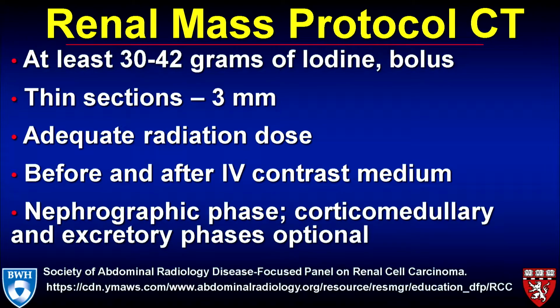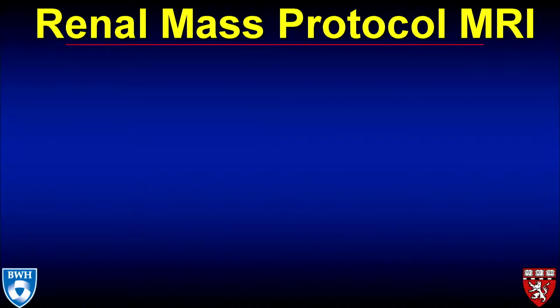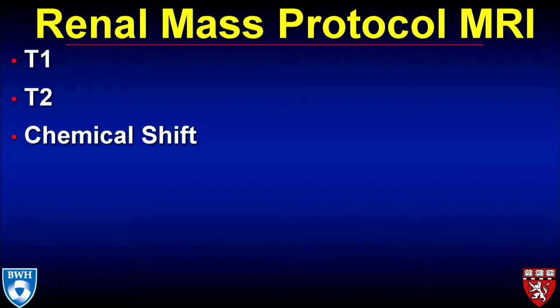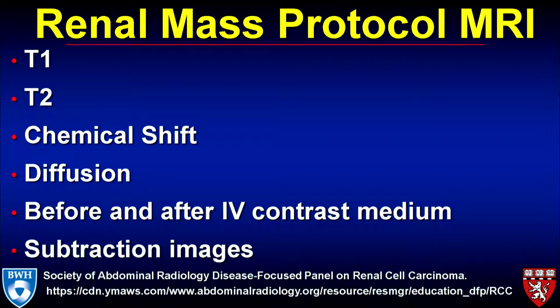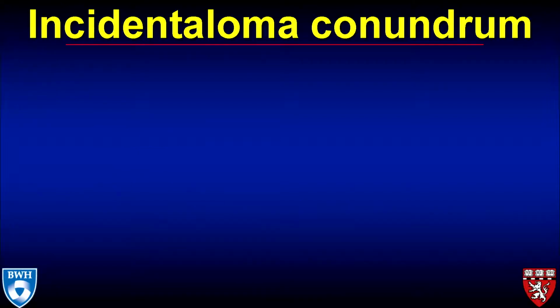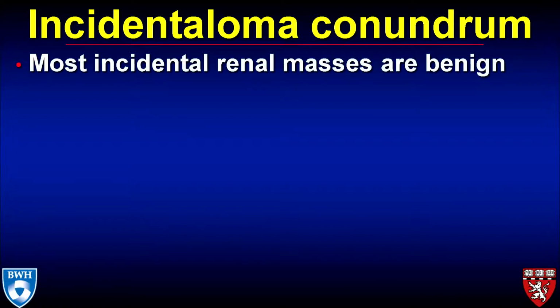I think you all know how to do a renal mass protocol CT or a renal mass protocol MRI, where these are the basic requisite portions of a renal mass protocol MRI. And again, I hope you all already know this. And again, this is all in your handout and also on the Society of Abdominal Radiology Disease Focus Panel on Renal Cell Carcinoma website.